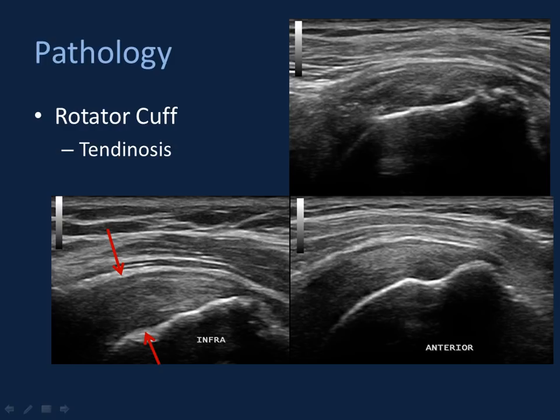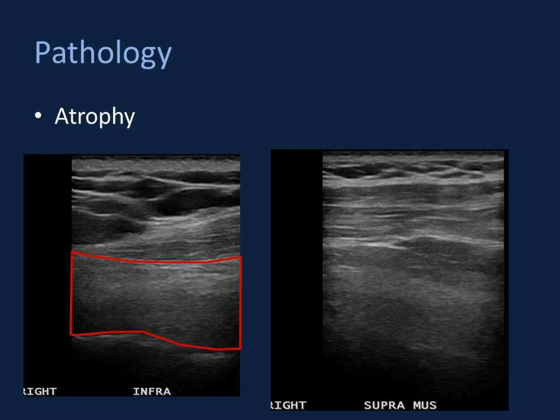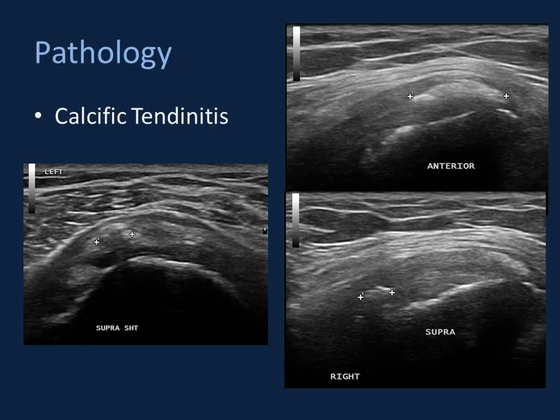Ultrasound is exquisite for identifying fluid — our ability to detect bursal fluid is excellent. In this case, abnormal fluid in the anterior portions of the subacromial subdeltoid bursa — likely the subcoracoid bursa — confirmed bursitis. Examples of muscle atrophy in the expected locations of the infraspinatus and supraspinatus fossae show loss of normal muscle architecture; these images look more like hepatic tissue — very coarse in echotexture with increased echogenicity. Severely atrophied muscle with adjacent peritendinous fat appears as asymmetric bundles of even more echogenic tissue — a finding useful for your orthopedic surgeon. Calcific tendonitis is also seen well on ultrasound: a large globular region of shadowing material of increased echogenicity representing calcium hydroxyapatite within the anterior supraspinatus fibers, and a longitudinal segment of calcification that shadows less.